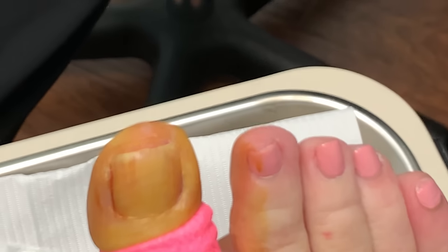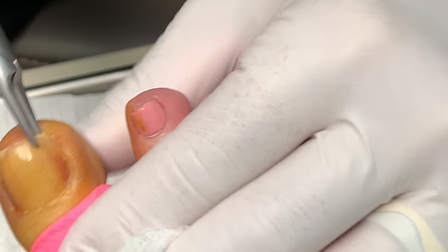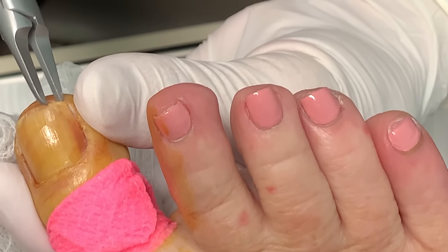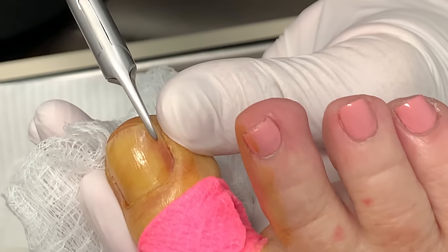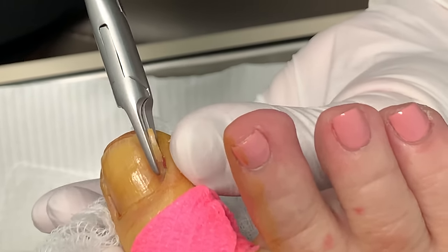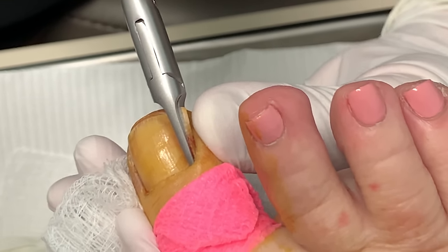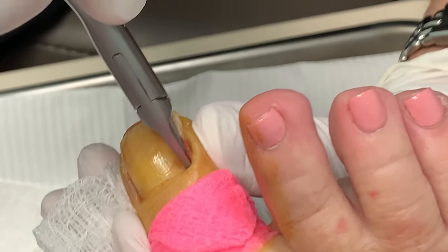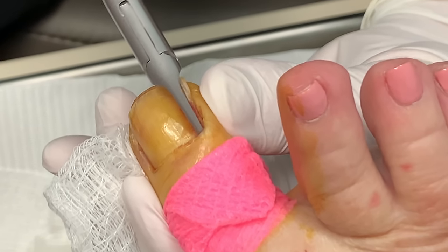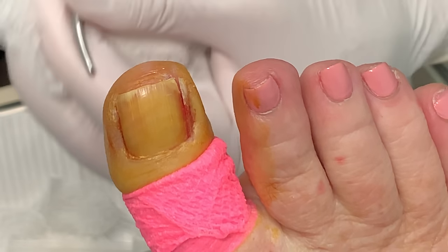So we're under the nail here and we've loosened it up. Now we're going to take it out. I like to do one at a time so you don't have to keep track of what you did. Let's go under the edge here. She was concerned with the look of this too, so we're going to try to slide this slowly. I'm going to have to clip a little first to get more under — otherwise if I slide it, even though I loosened it, it can loosen the entire nail afterwards, and the drainage will lift the nail so it's kind of mangled for a good six months while healing. That's perfect — just enough to get the ingrown out, and now we can clamp onto it and pull it out.